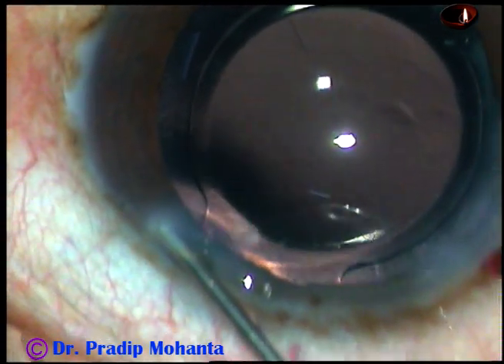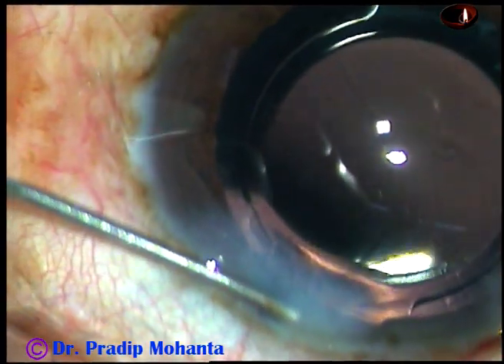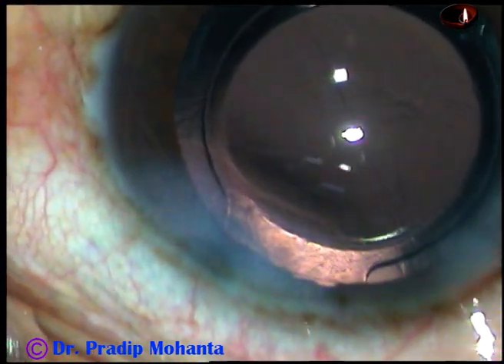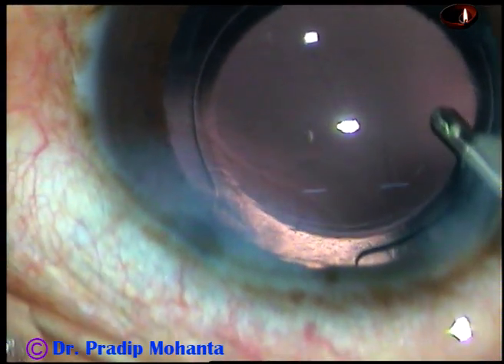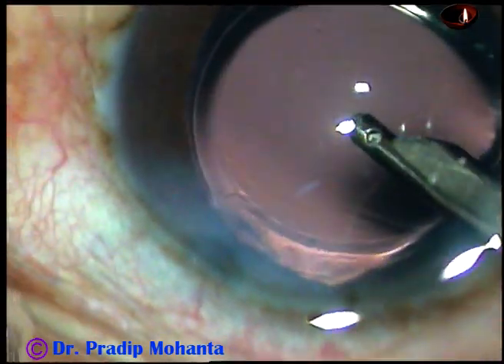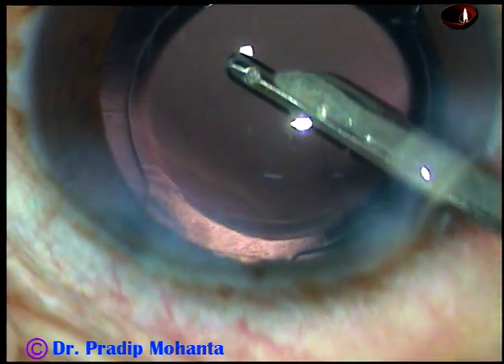And now the side port is closed by hydrating corneal stroma. Now this is the final lavage of the anterior chamber.